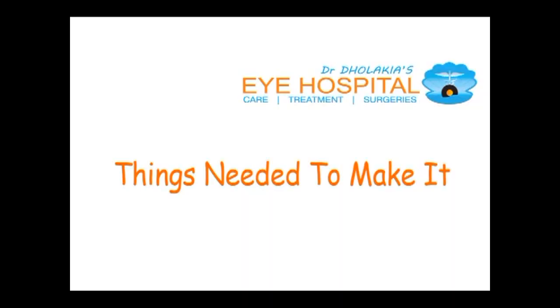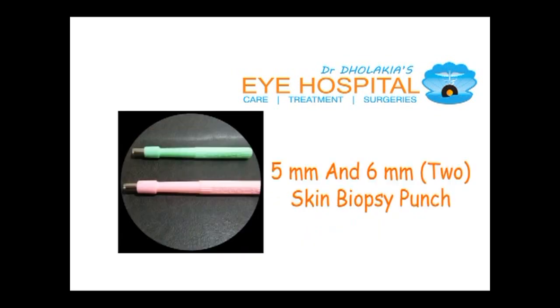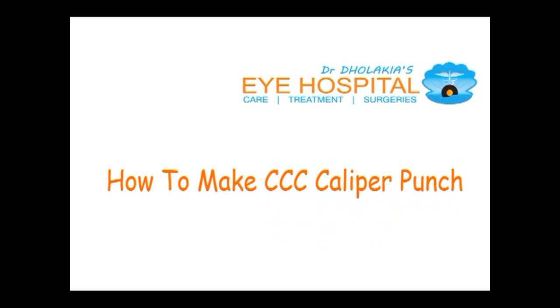Let us think about what things are needed to make it. You need a silicon key guard of a laptop keypad, and you need a 5 millimeter and a 6 millimeter skin biopsy punch. All these things are very easily available in the market.